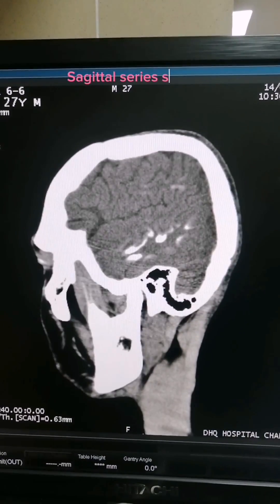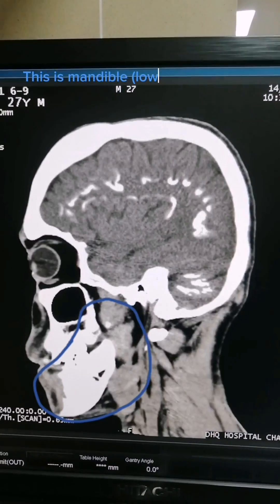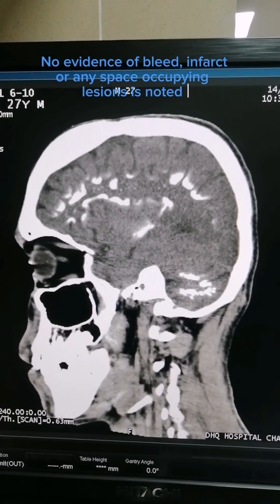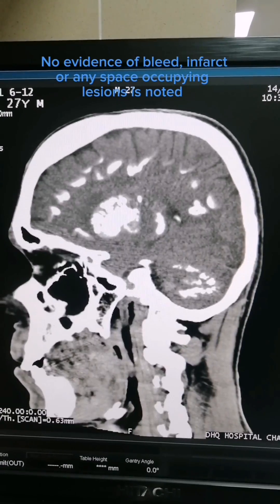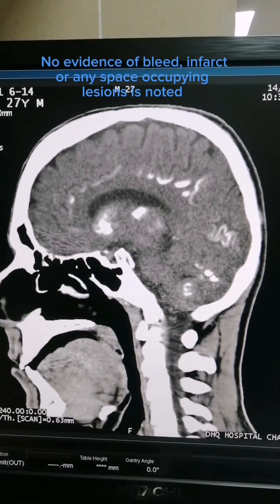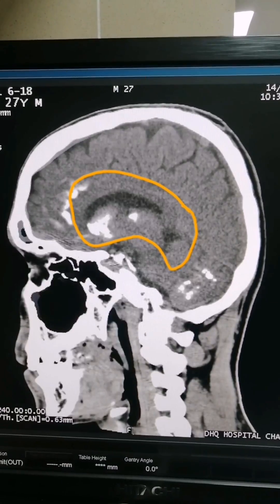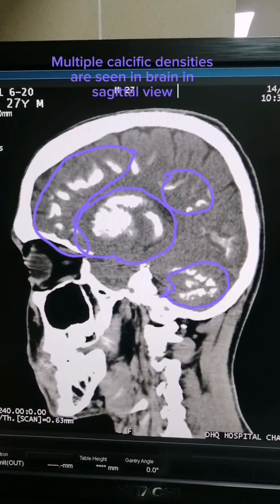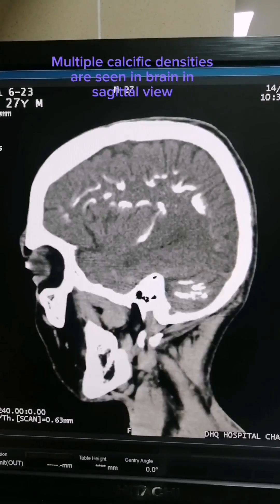Sagittal series starts. This is the mandible, lower jaw bone. No evidence of bleed, infarct, or any space-occupying lesions is noted. Ventricles seen on sagittal view. Multiple calcific densities are seen in the brain in sagittal view.